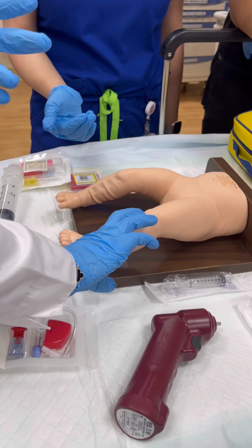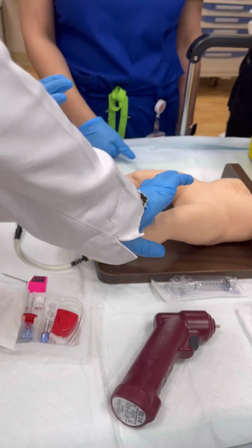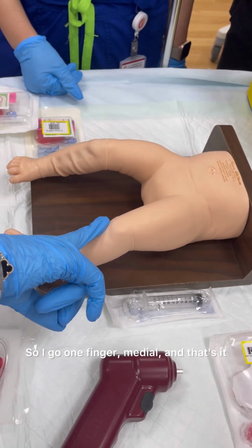Next, two fingers where? Left or right? Medial. So do I go one or two fingers? In kids, it's one finger. So I go one finger, medial. And that's it.